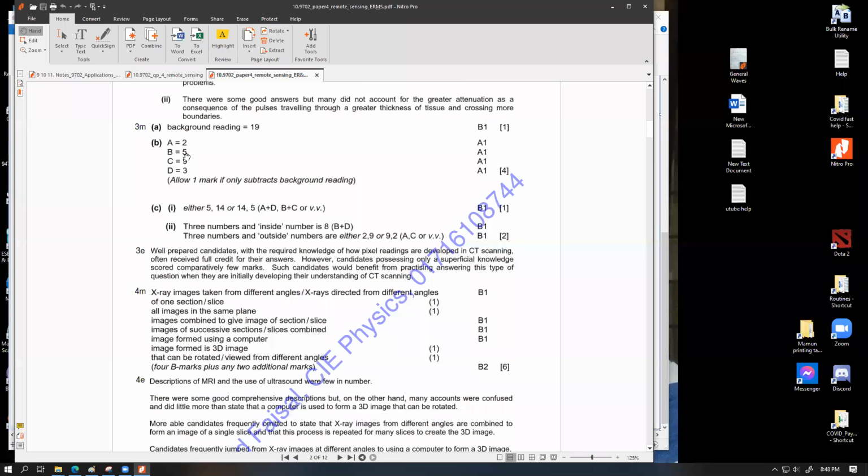If someone messes up this calculation by any means, they are going to get different values for this table. Try to understand what I'm trying to say. First of all, if you subtract and eventually end up dividing by 3 and do not get integer values, you should know that somehow you are making a mistake, because you are supposed to always get, for the sake of simplicity, integer values for this pixel value, voxel values. For your syllabus, you're not going to get fraction values. They don't show up. In a real case, they might, but I didn't study that, so I can't confirm this information.